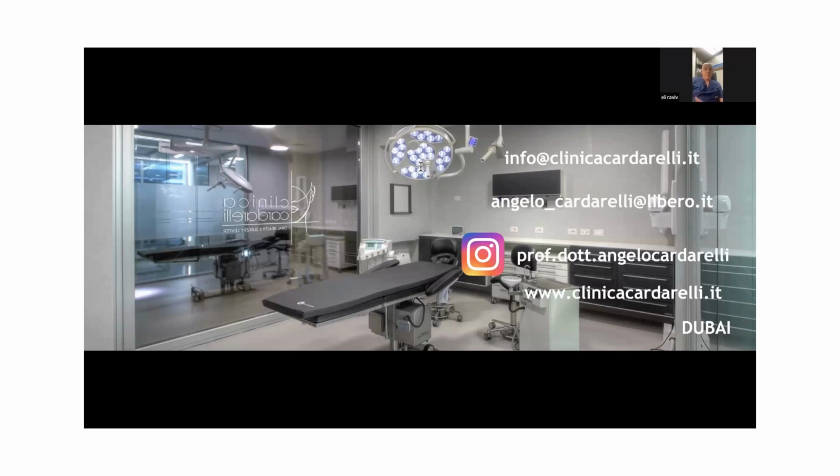I totally agree with you, because I understand, and that's what I thought. Also because the patient has already had this edentulous side for many years, so in that case I prefer to reduce the risk, especially on the customized implant, because this is a new approach and we don't know what's happening in the future. So slowly. For sure, if we have a dentulous patient and we need to make immediate loading, we can do. But if we don't have the exigence from the patient to make immediate loading, it's better to wait, I think.